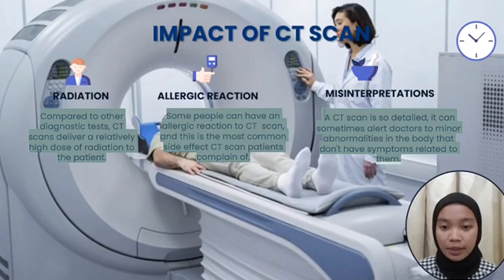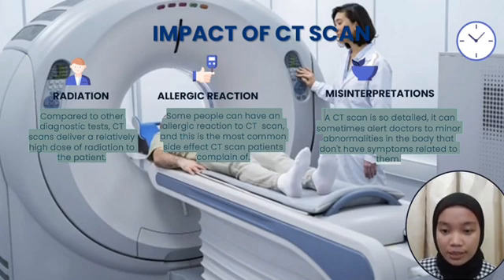Impact of CT scan. The first one is radiation. Compared to other diagnostic tests, CT scan delivers a relatively high dose of radiation to the patient. While this is not usually a problem for a single scan, patients who need to undergo repeated tests can be subjected to a significant level of radiation, increasing their cancer risk.